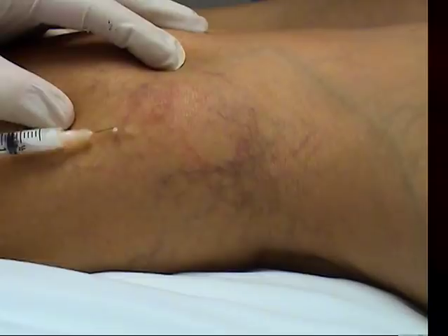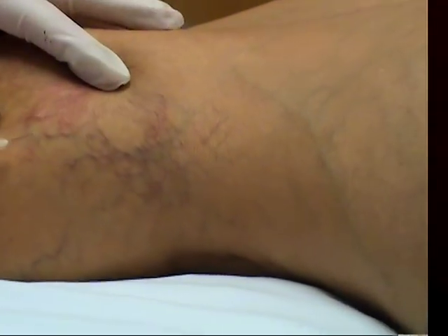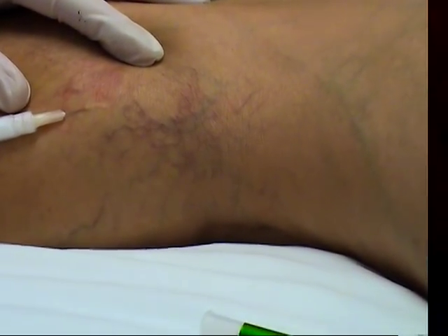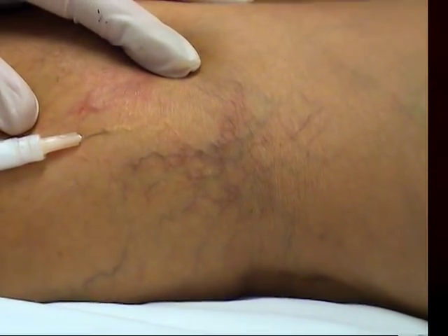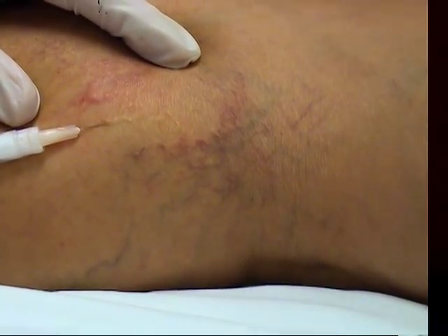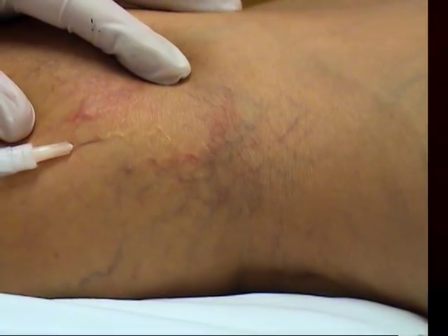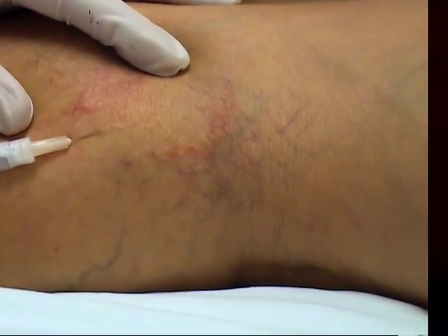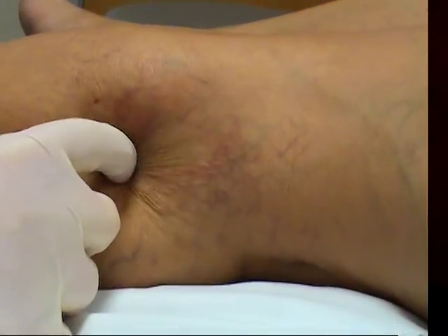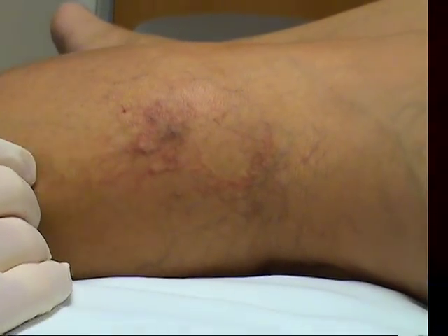Once it fills up it will take some time for the blood to come back again. You can see right at the tip of the needle there's a bit of extravasation, so I'm going to stop there and go over here. Foam on foam here. See that's going nice again. Don't inject too hard. We've got foam just north of the site that I'm injecting — all these veins look nice and white now, they're all foamed. Now obviously you don't want to extravasate, but just a little bit won't do any harm. Plus don't forget that three quarters of this is air, so it's even better.